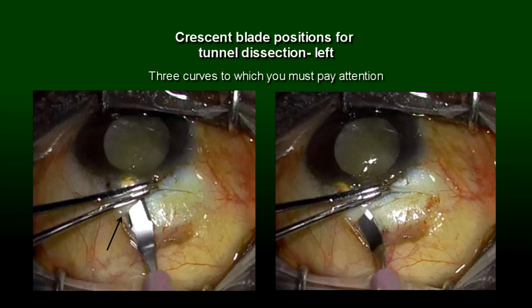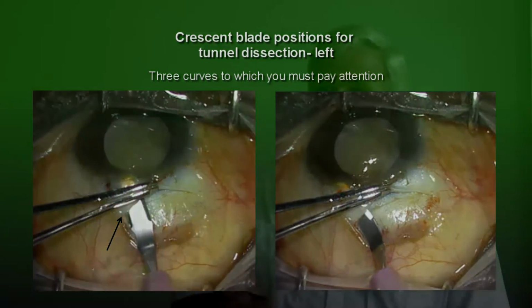So this tunnel thing really is the most complex part of the procedure, and it's not hard to see what it's supposed to look like, but producing that shape when you have all those curvatures to deal with is why it takes a little practice to get used to it. But again, a good thing about this is that it's not unlike peeling a grape. All those curves are the same curves you find on a round piece of fruit, like a grape. So if you can peel a grape and follow the curves on a grape, that helps you learn this same pattern for the eye.